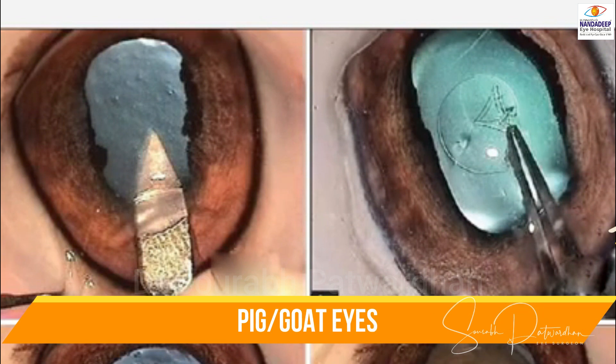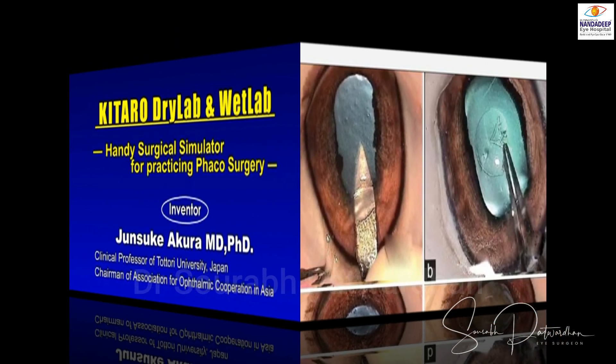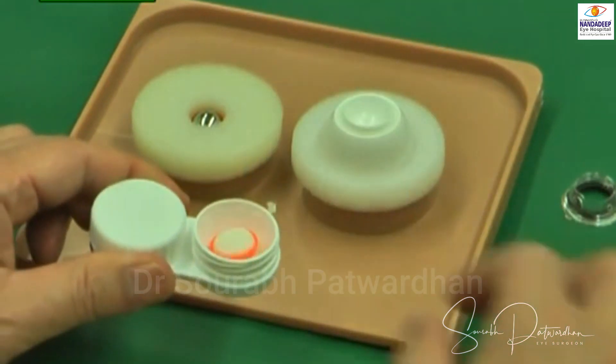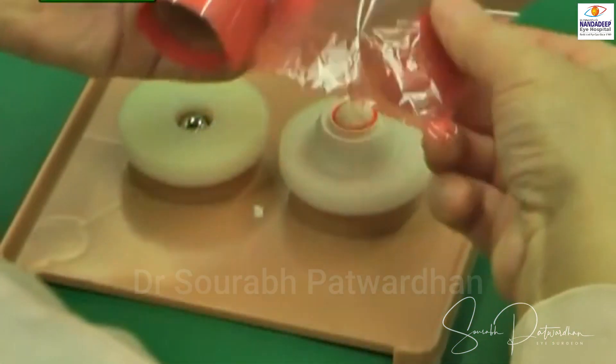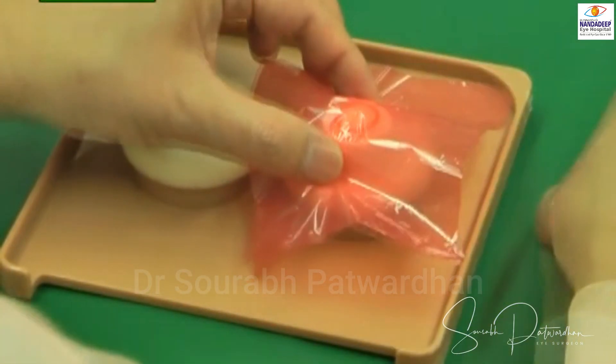What we use in our setup is the Kitaro dry lab and wet lab, which is very useful for beginners to learn the skills and learn the movements that are to be used during the different steps of the surgery.